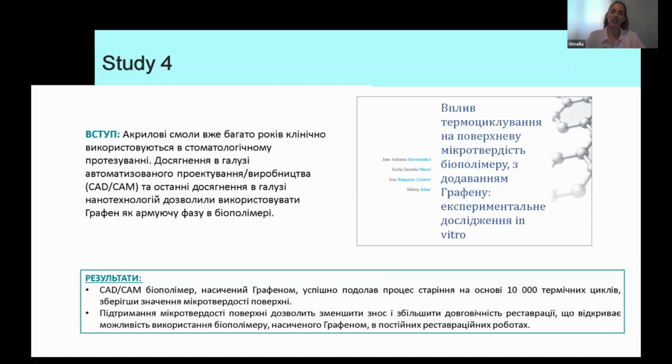okay? Here I always want to make an aside: it's not the same that my material could be stable over time as, for example, that I could have a failure in my prosthetic. Later, I'm going to explain to you the best way to work with our material, because obviously if I don't follow the design recommendations, I could have a failure, okay?